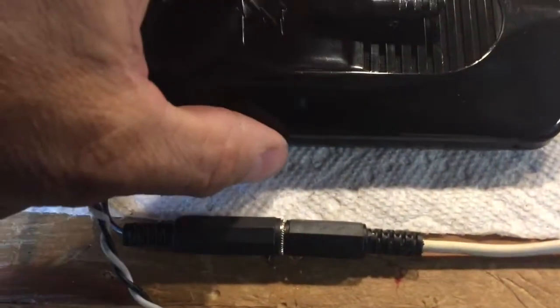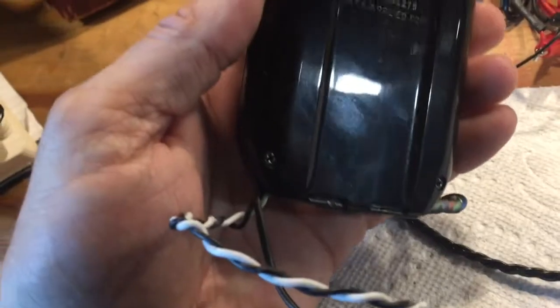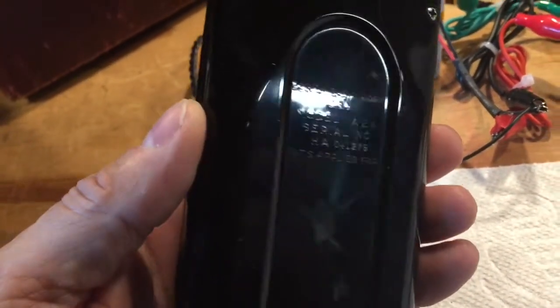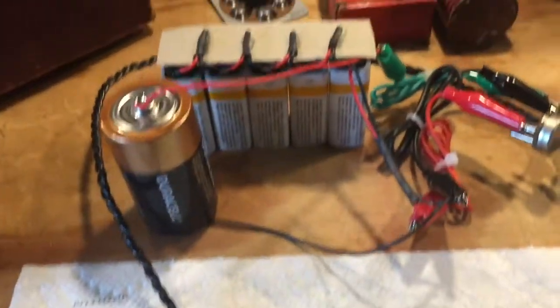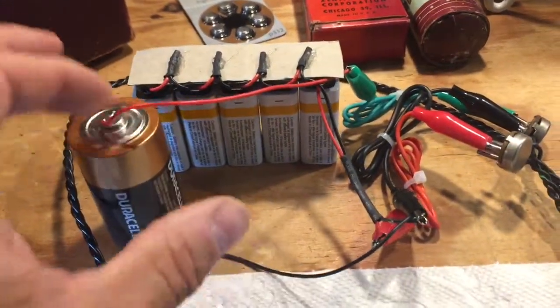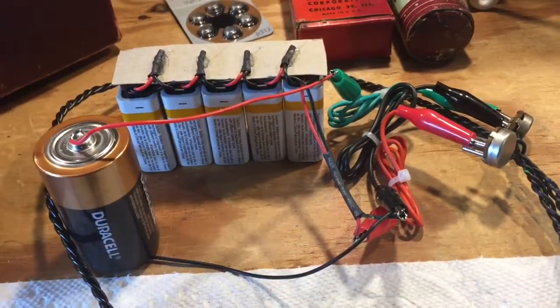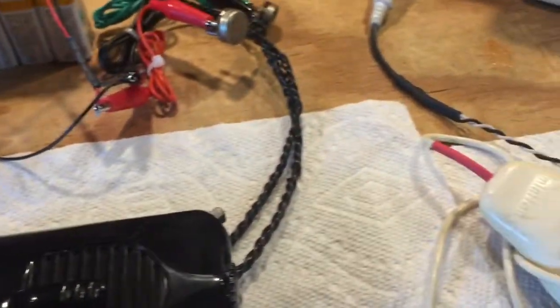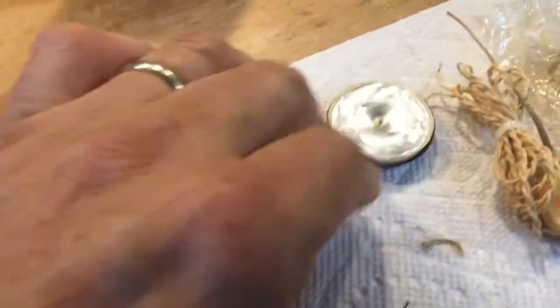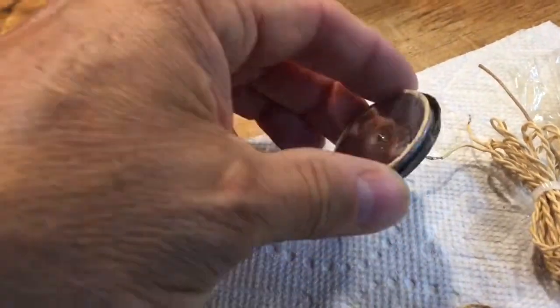The Zenith hearing aid model A2A is finished. I replaced five capacitors, made a battery pack for the anode, and replaced the single D cell for the tube filaments. I've also made a couple of modifications just because I wanted to be able to illustrate it actually working. So let's start at the beginning.